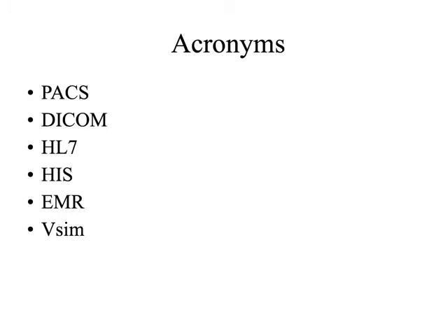These are largely related to data communication. PACS, right? We should be familiar with that. Picture Archiving Communication System. This is the way we send stuff to mass storage, or from mass storage to, honestly, my cell phone now or laptop or wherever else we send it. It is the system that sends it.